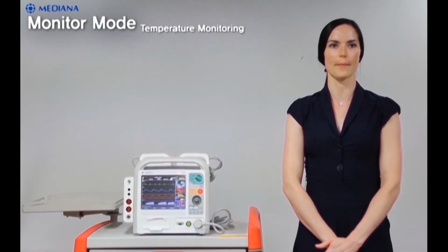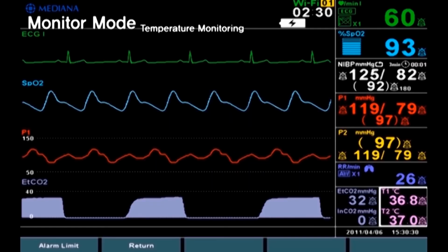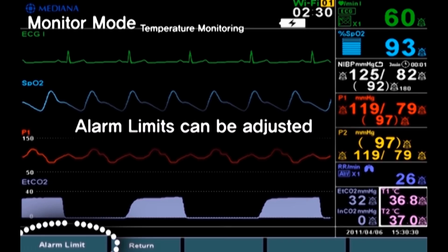Next is the temperature monitoring. Here you can see how the temperature measurements are presented on the screen. In the temperature menu, again, only the alarm limits can be adjusted.